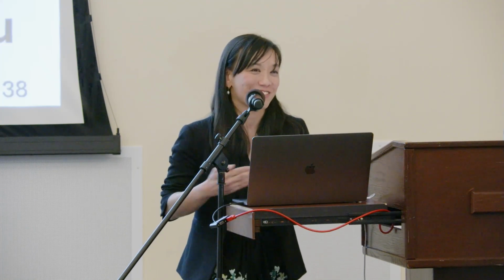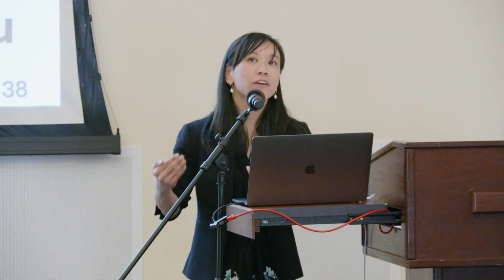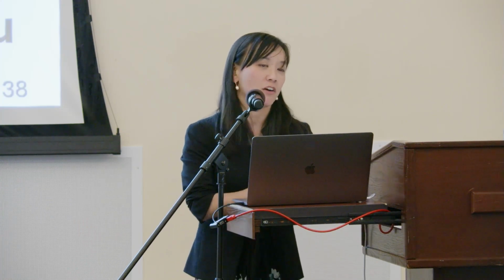So one thing is just to be cautious, especially in the lower frequency band, there is still synchrony and contribution of heart rate. The higher one, I think, is a little bit newer and needs more interpretation, especially since resting state fMRI has become faster and faster. That's how we can get these high frequencies in the first place. From a methods perspective, that's interesting. We should keep going fast if we have sufficient signal. But biologically, those bands do relate to the natural frequency bands of heart rate variability. But I don't know if there's additional biological underpinnings of that.